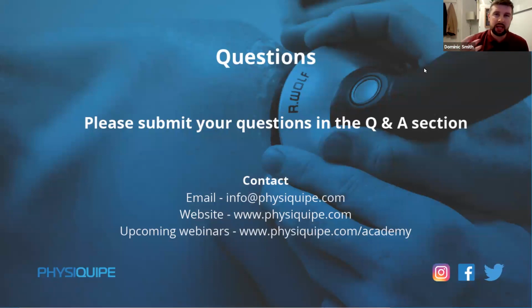Any points of pain that I get from the patient where they're saying, oh, that replicates the pain that I feel, which is a really important point. That's what you get with focused, it quite often replicates the patient's pain sensation. I'll stay there for a little bit until that pain eases. Where you can, you want to try and actively or passively move them. So whatever range they have, try and move them in that range. But where they're experiencing the tightness, where they're reporting the restrictions, I'd aim for that really. Yeah, perfect.